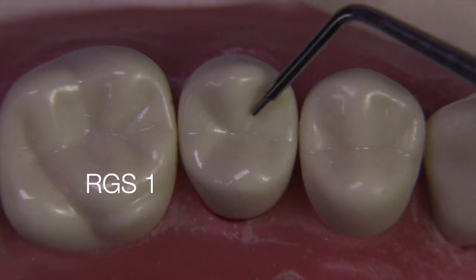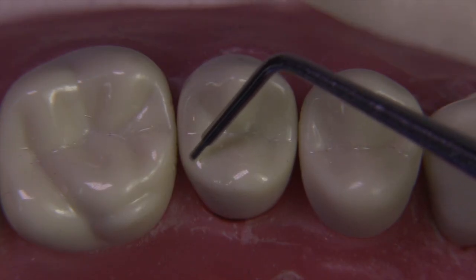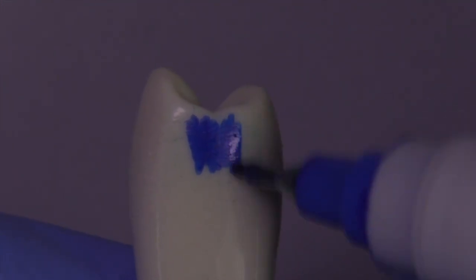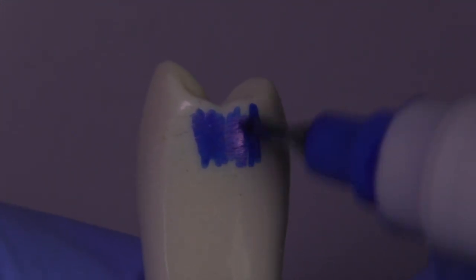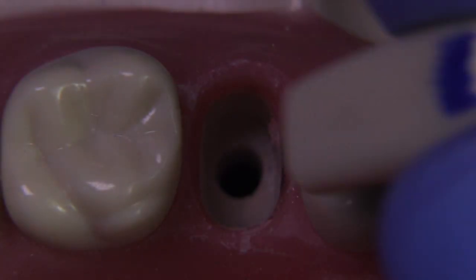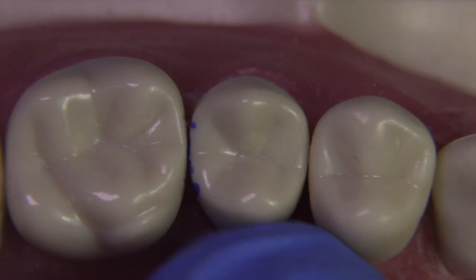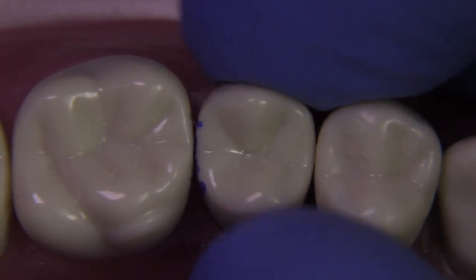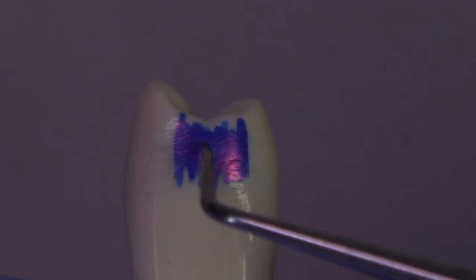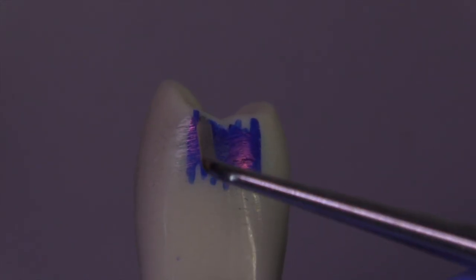Today we're going to be covering the class 2 DO on tooth number 4 on the Columbia Typodont, probably the most difficult class 2 we have. I'm putting a little marker here to show you the extent of the contact, and that's really the reason why this is such a difficult prep.